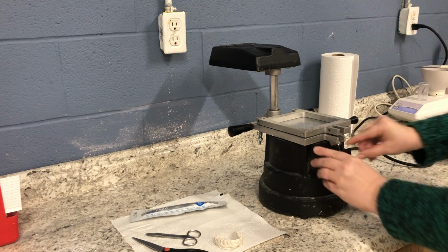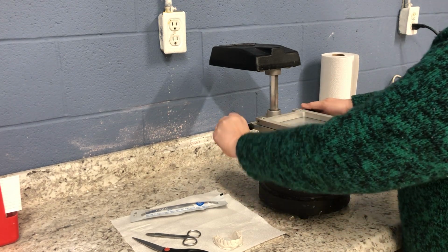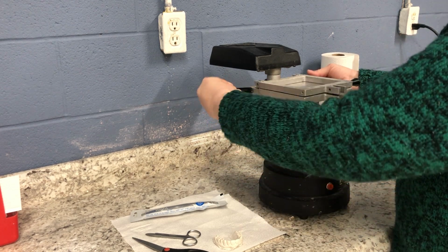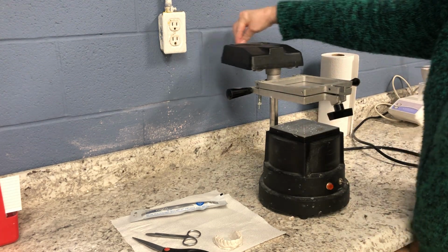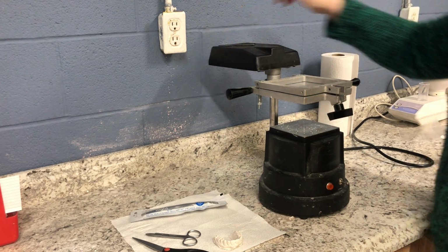This is spring loaded. This knob here, if you turn it towards you, it locks. If you turn it away, it'll raise up and down. Turn it back towards you to lock it. And then we're going to pull this around to heat up the bleaching material tray.